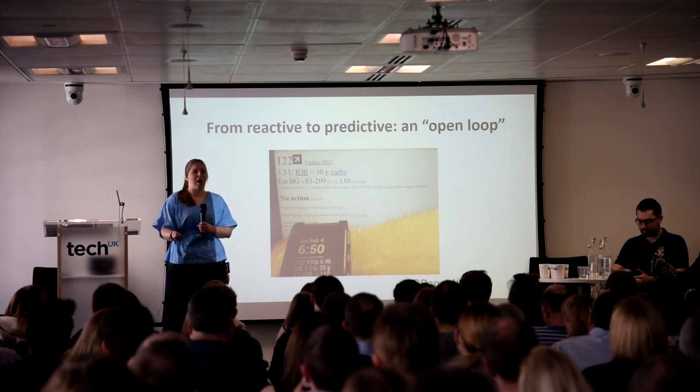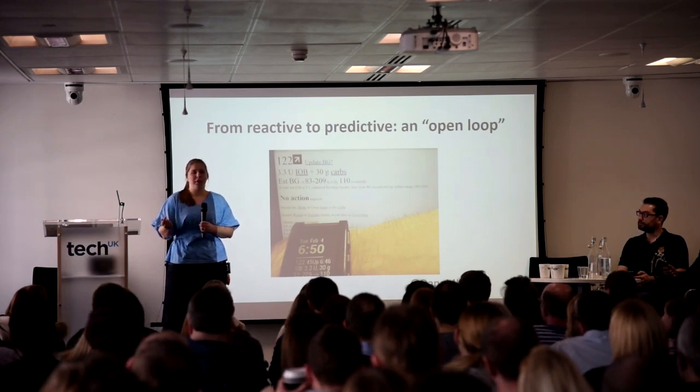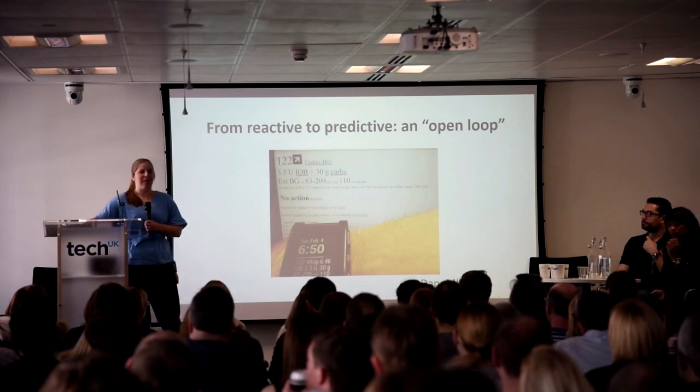have this great algorithm that can basically do everything, and it wakes me up and tells me to do something. But instead of waking me up, why don't we just tell the pump what to do? And tell the pump to give me more insulin or less insulin to ward off the lows and the highs? Could we do that? And the answer was yes.